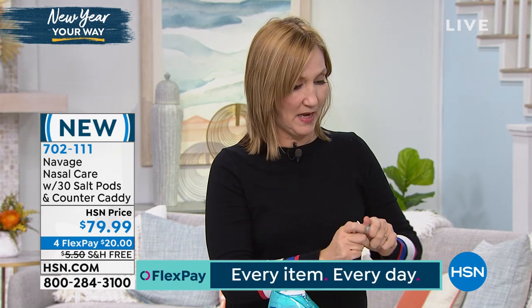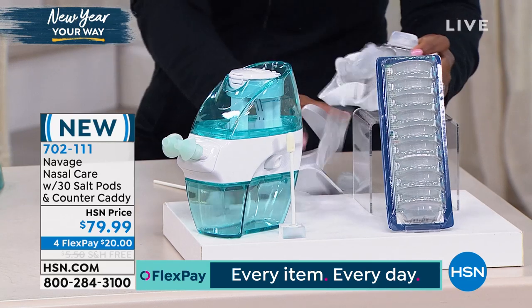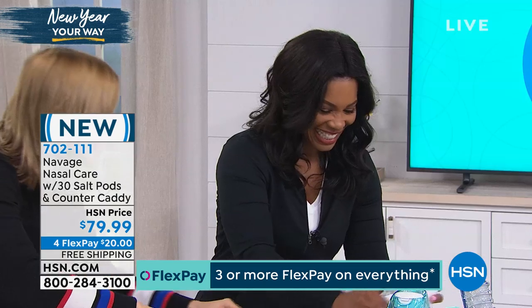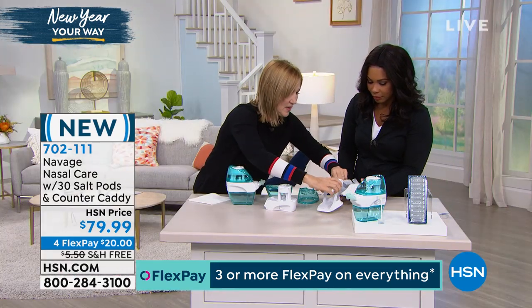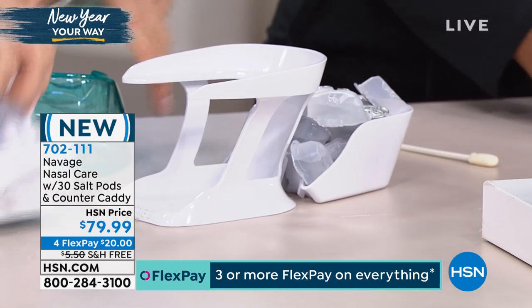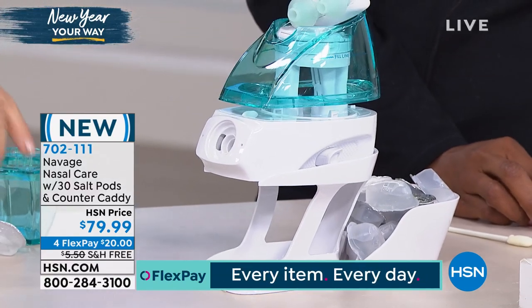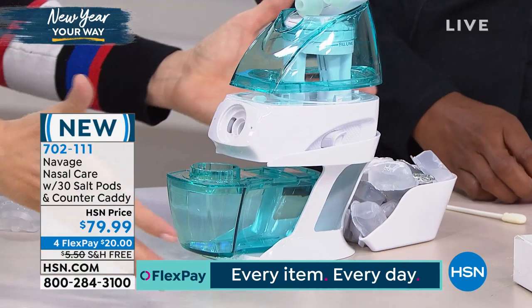What I like about the countertop caddy is that I store it for daily use. It's got so many salt pods that come with this — they're just going everywhere, but look: you've got your extras in the back, and then you place this here, this here, this here. And it dries beautifully.